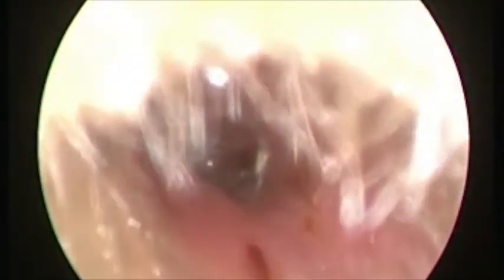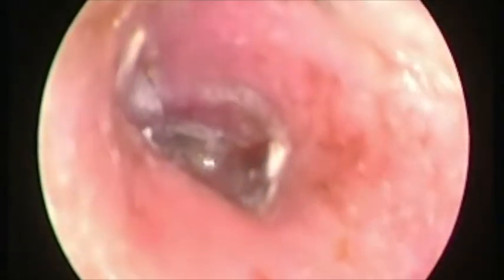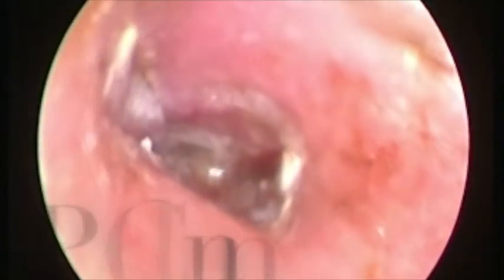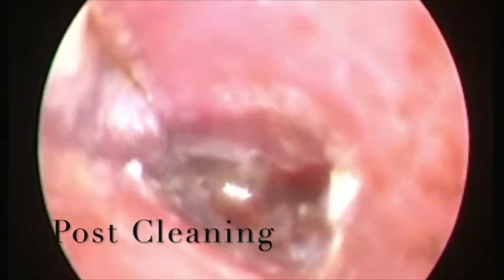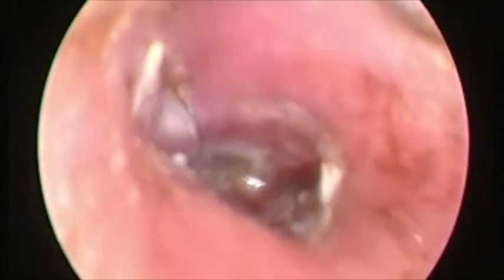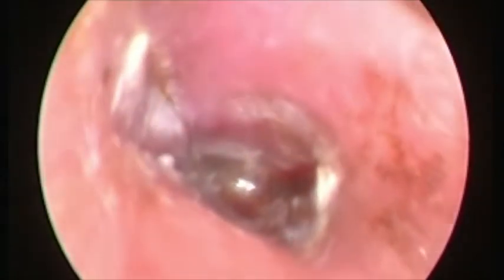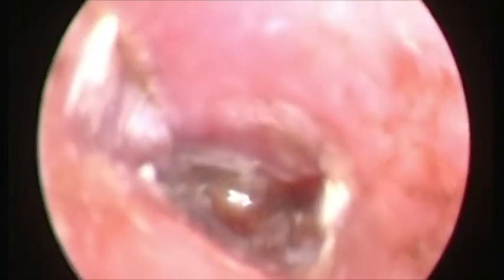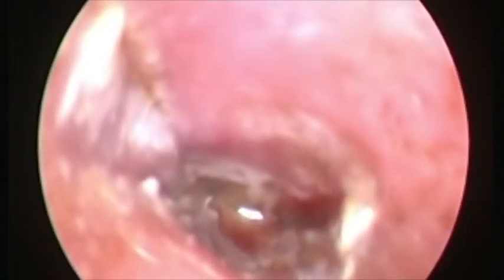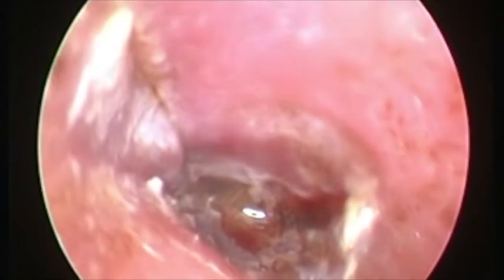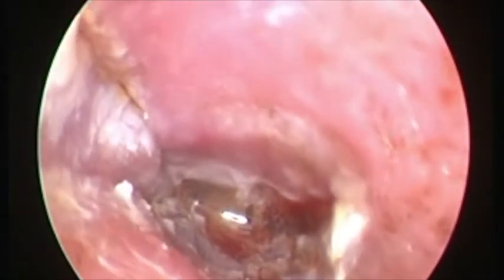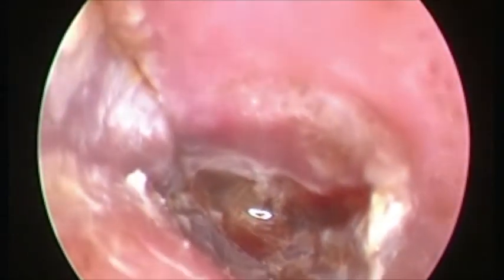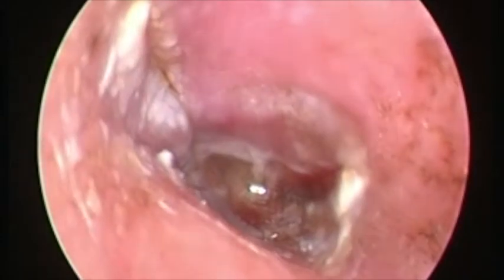This is the external auditory canal after cleaning the ear. We can see the trauma on the canal and the inflammation of the eardrum. Treatment will comprise of antibiotics to prevent infection and topical ear drops to reduce the infection and inflammation.